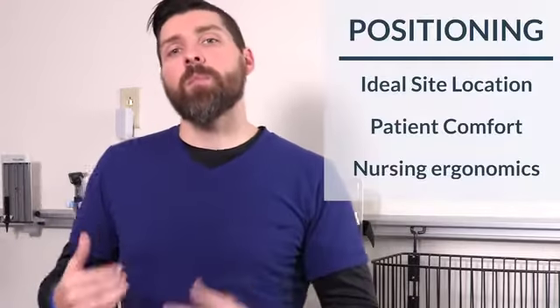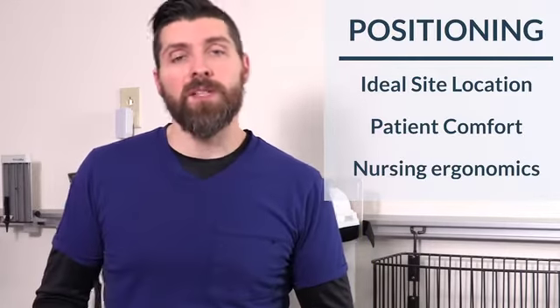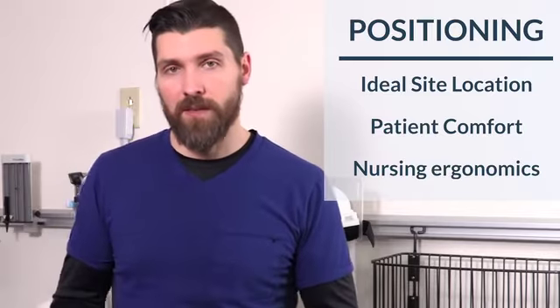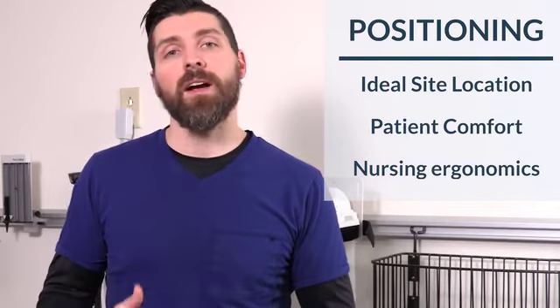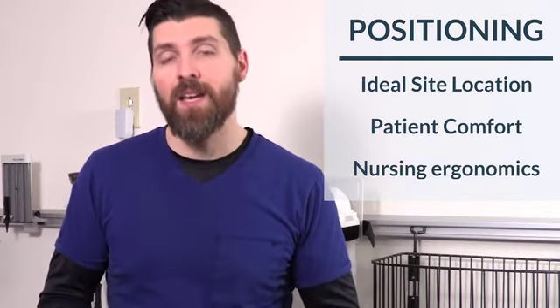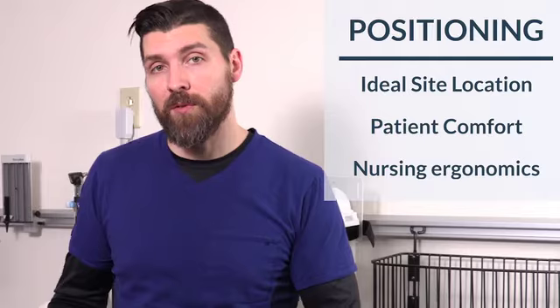The second thing is patient comfort. You never want to put your patient in a compromising position where it could affect them health-wise or something that's uncomfortable. If they're uncomfortable, they're not going to be compliant, they're going to wiggle, you're going to have a more difficult time getting that IV set. So always put your patient in a very comfortable position.